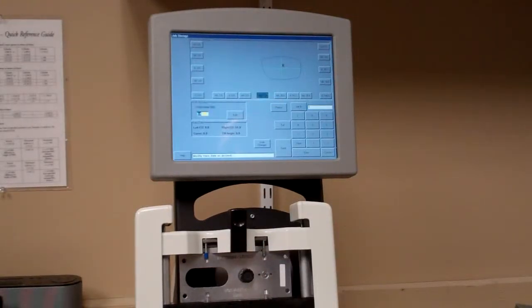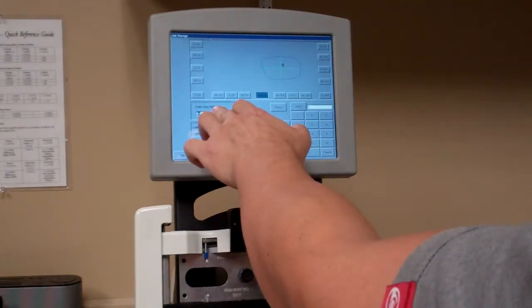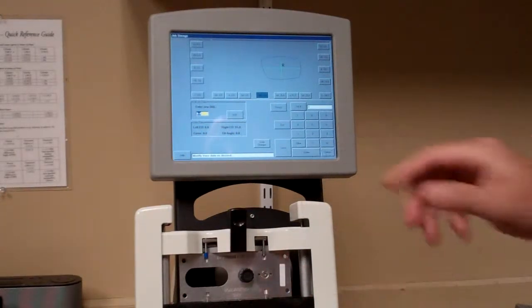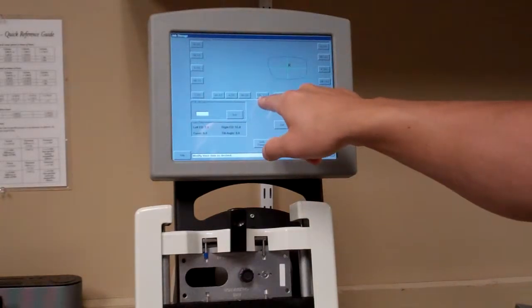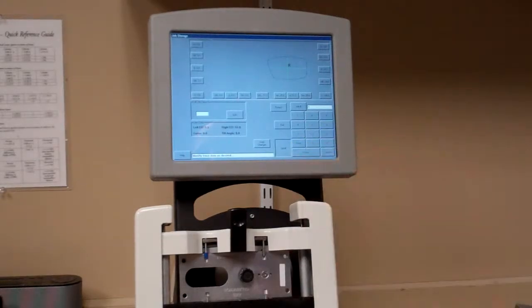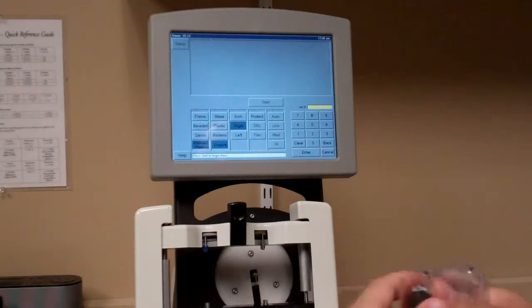Once you get the right eye traced, it's going to prompt you to enter the distance between lenses, which is located on the frame. This one is 17, so hit 17-0 and then enter. Once you hit enter, it'll populate the DBL up here, and then send will highlight — go ahead and hit send or save. Once it goes through it'll pop back to the home screen and you're good to go.